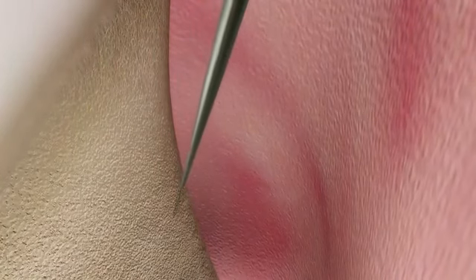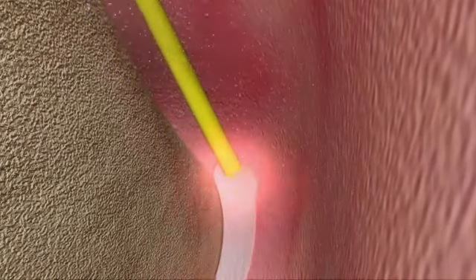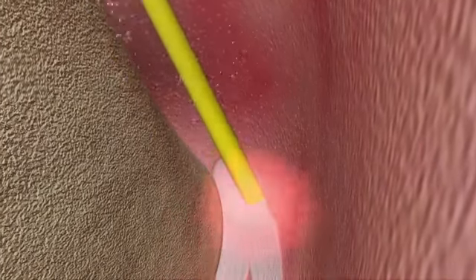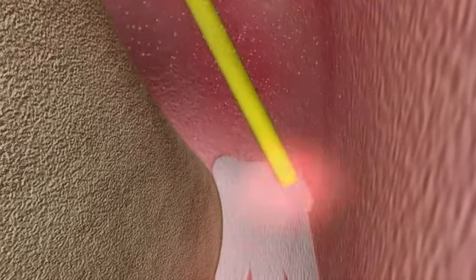If any calculus is remaining, the Erbium YAG laser is used to remove it. The Erbium YAG laser is then used to dissect the periodontal attachment from the bottom of the pocket to the bone. This is necessary to stimulate the regenerative factors from the bone that will help with healing in the periodontal defect.